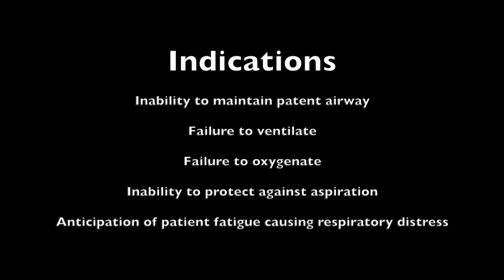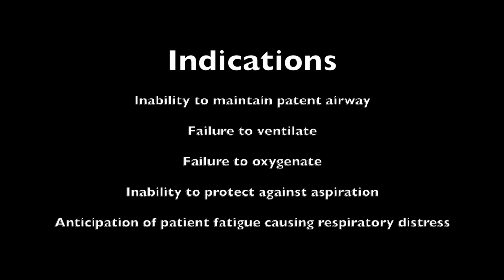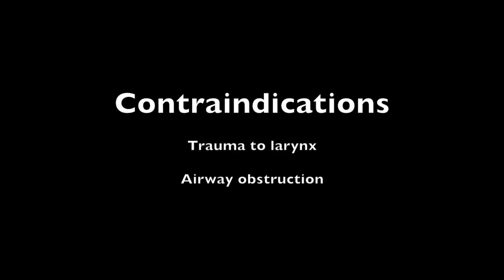Indications for endotracheal tube intubation include inability to maintain patent airway, failure to ventilate, failure to oxygenate, inability to protect against aspiration, and anticipation of patient fatigue causing respiratory distress. Contraindications include trauma to the larynx or airway obstruction.